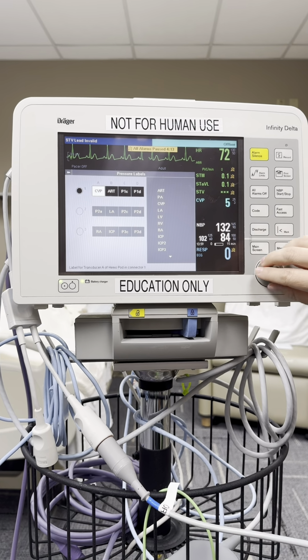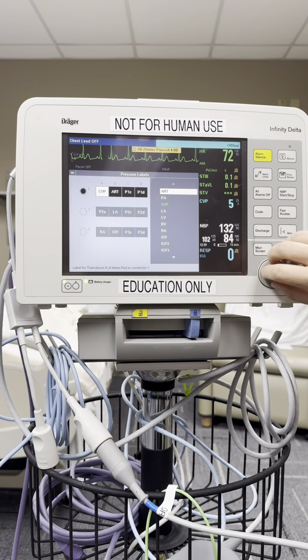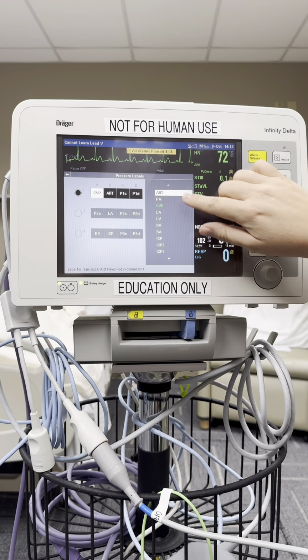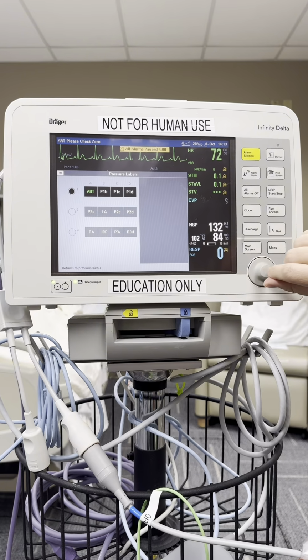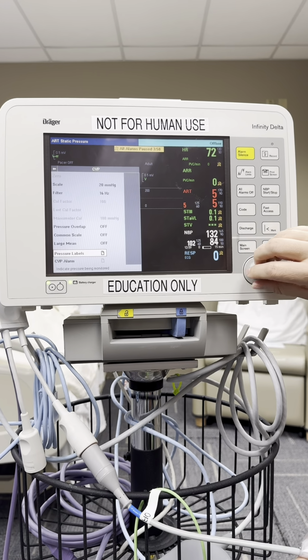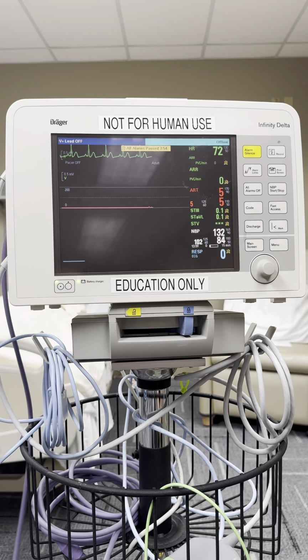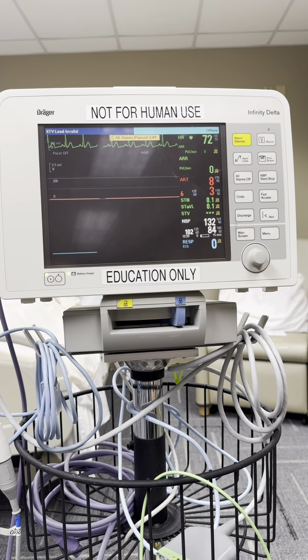So we'll scroll over to select the one that's green, click it, and then you can scroll through your different options, whether you want an ART line or a PA line. Select which one you want, and that will change it on here. Once we go back to the main screen, we should have the ART line showing up here, and that can make sure that we're getting correct readings for whatever line you have.